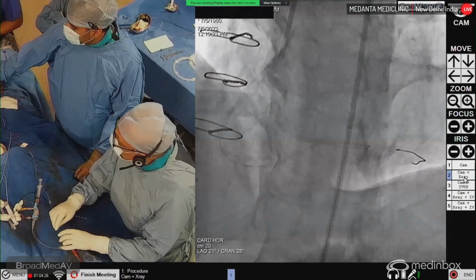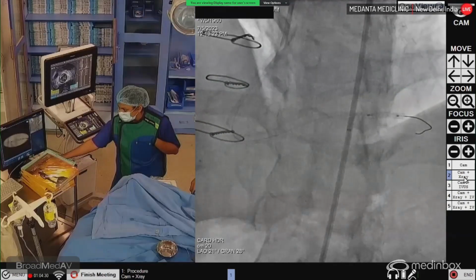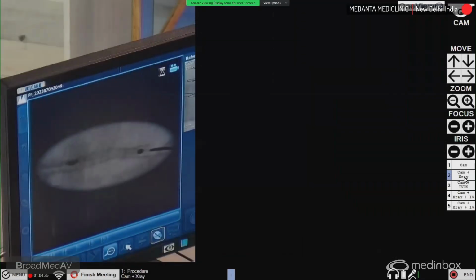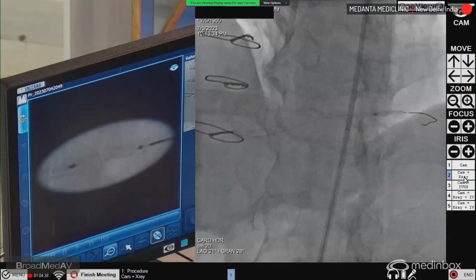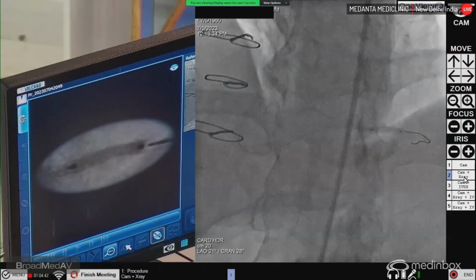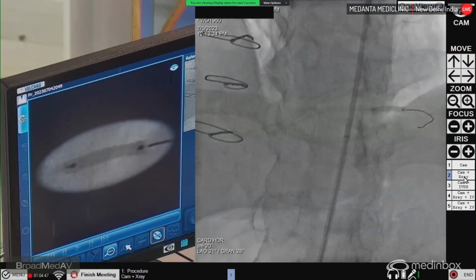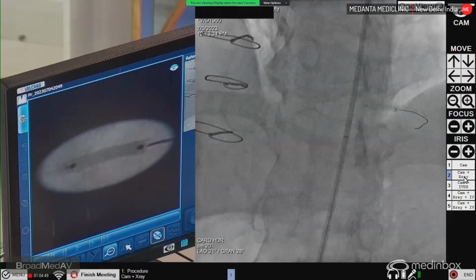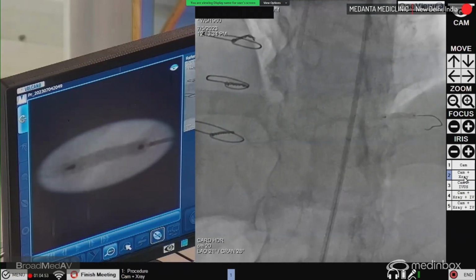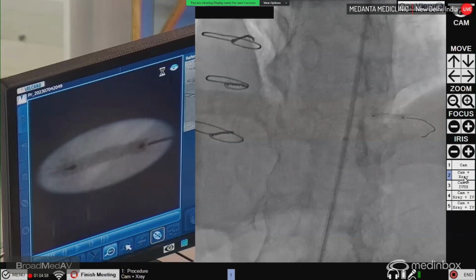Okay. So you can see on this image that we are quite inside. Show me the star. That's right. The stent boost. Okay, go up, please. 1, 2, 3, 4, 5, 6, 7, 8, 9, 10. Okay. I cannot go too much on this. We'll wait for a few seconds. It is expanding. So we must give some time for the balloon to expand the lesion. And you see that it is very well expanded now. Okay, deflate.